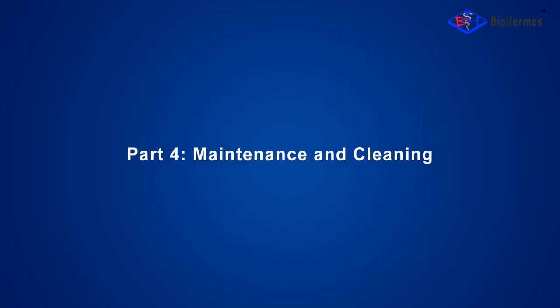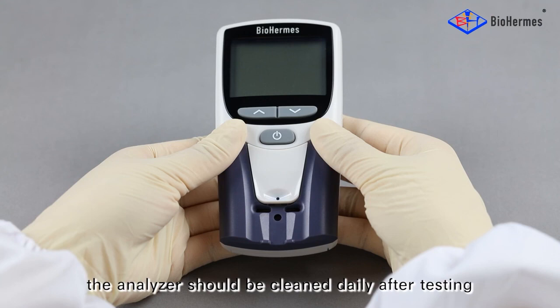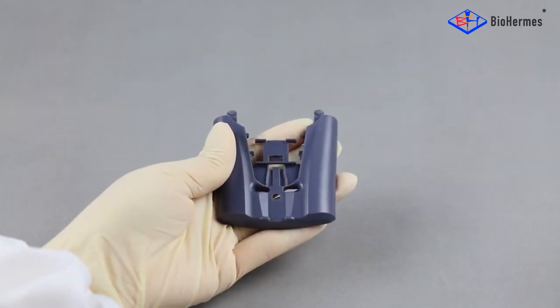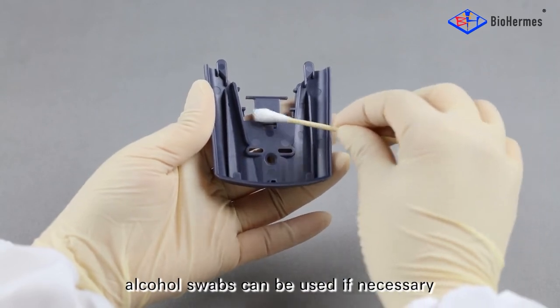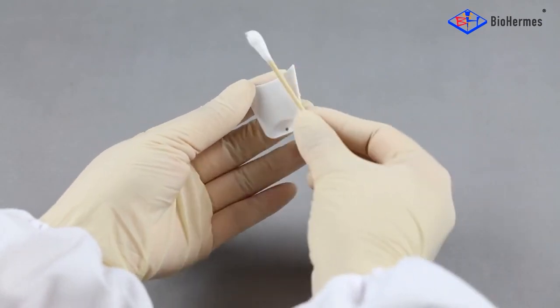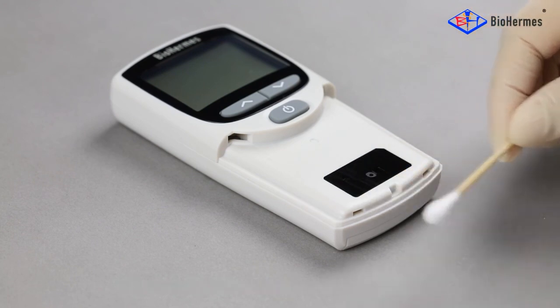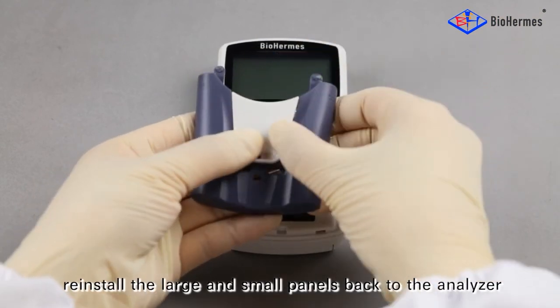Part 4: Maintenance and Cleaning. In order to get accurate results, the analyzer should be cleaned daily after testing. Remove the large and small panels from the analyzer. Use a swab to clean the panels carefully; alcohol swabs can be used if necessary. If the LED detection light is contaminated, please wipe the area in a single direction. After cleaning, reinstall the large and small panels back to the analyzer.